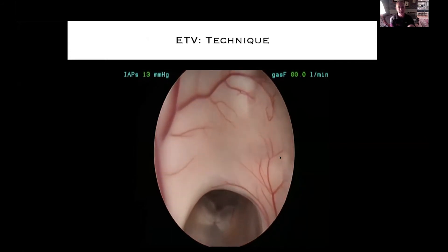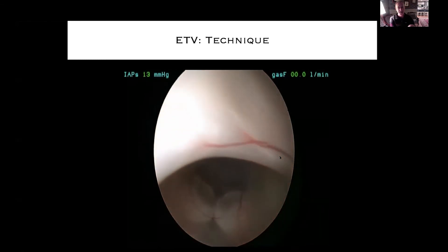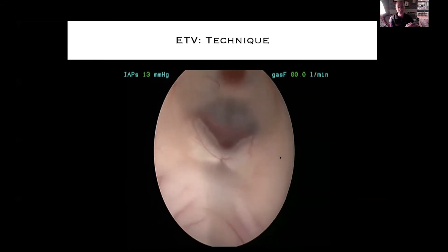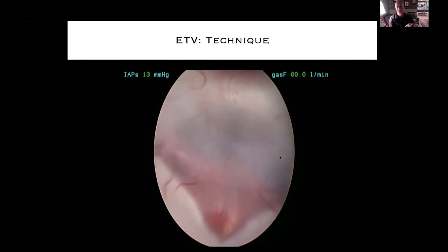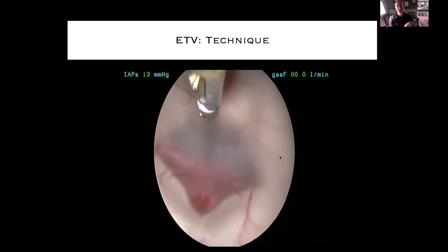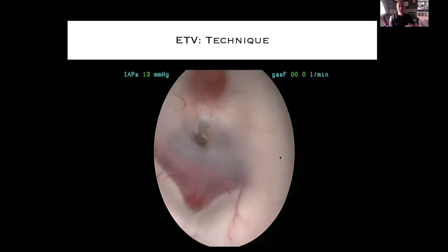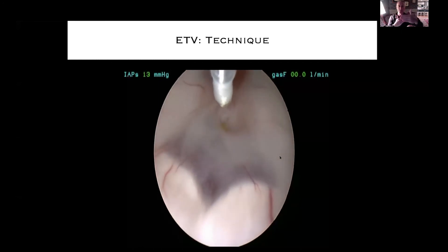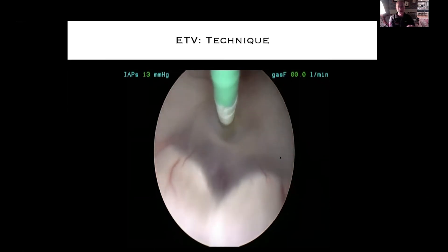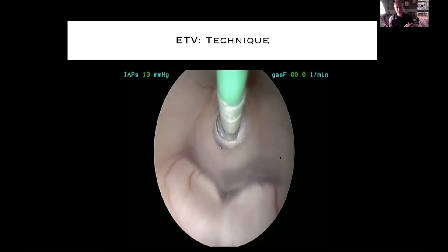Here's a more appropriate vertical orientation — nice anatomy. There's the fornix; you're going to angle the scope down and come into the third ventricle. There are your mammillary bodies — you get yourself on midline. The floor of the third ventricle is a bit clearer, so you can actually see the vascular complex — probably the basilar artery, with the PCA going out laterally. The clivus is right where the device is angled. What I like to do is find the dorsum sellae and ride down it, particularly where there's a very narrow interval between bone and the basilar artery — you can almost slide off the dorsum sellae into the pre-pontine space without the risk of vascular injury.